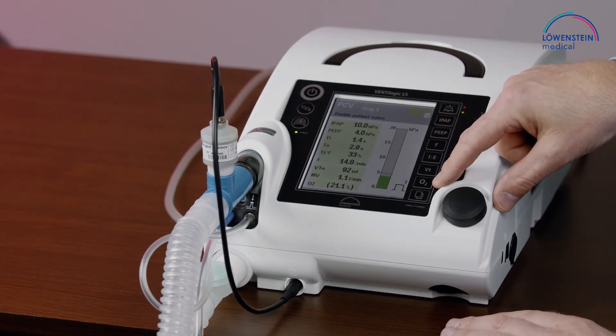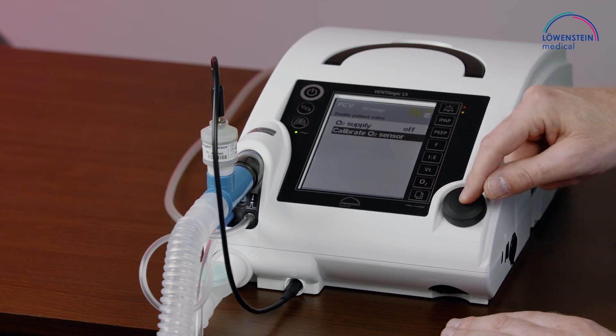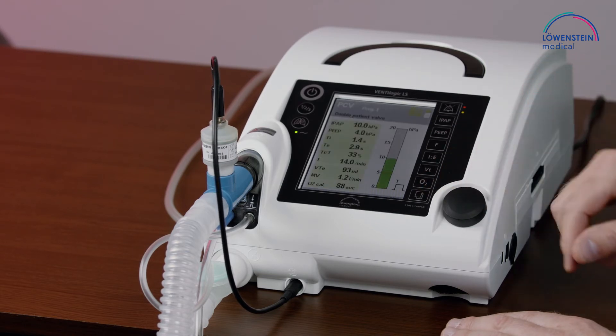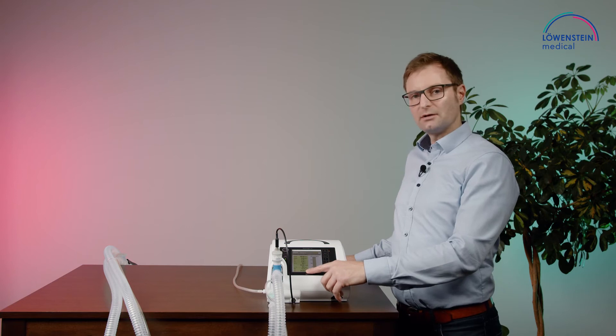I will press the button for O2, go to calibration, and calibration starts. It will count down 90 seconds, and after 90 seconds the calibration is done. Now the calibration is done.